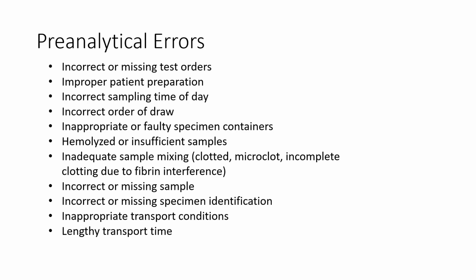Inadequate sample mixing. If you don't mix the tubes appropriately when they are drawn, it could lead to clotting, and microclots could exist. Incomplete clotting due to fibrin interference. So you want to make sure that when you draw particular tubes, you are mixing them appropriately at that time.